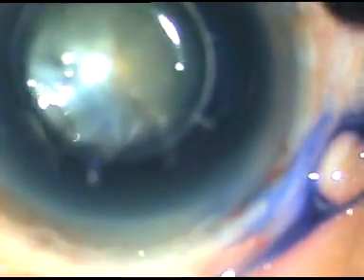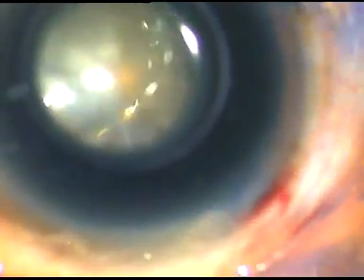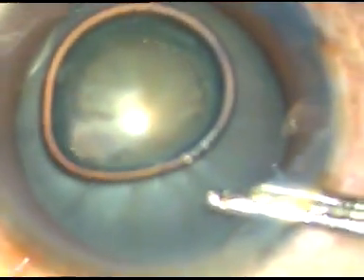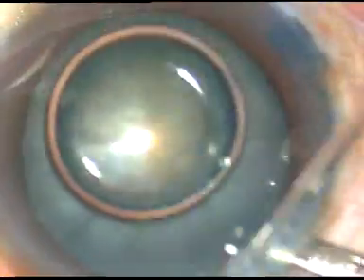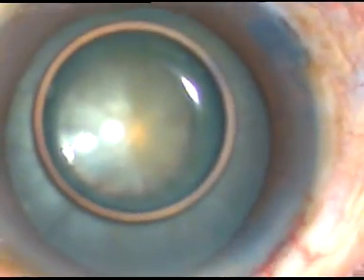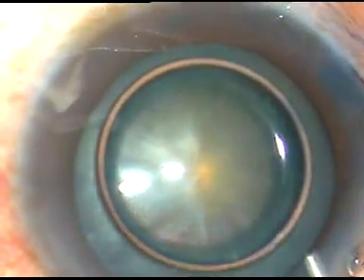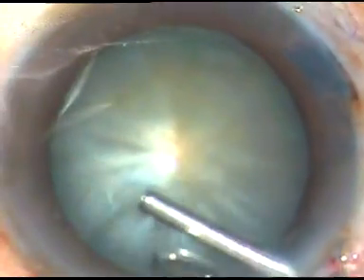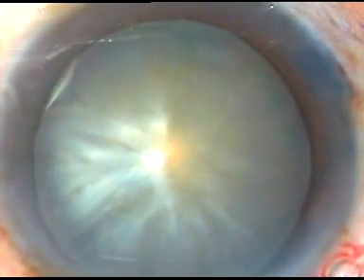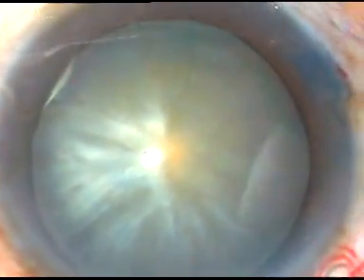After making the incisions, the anterior capsule is stained with trypan blue dye, but in this case staining was not satisfactory. However, I just washed out the dye and thought it is enough. Now I inject viscoelastic substance — this is hydroxypropylmethylcellulose. I don't use any high molecular weight viscoelastic substance in intumescent cataracts.